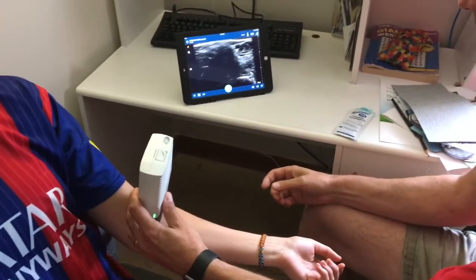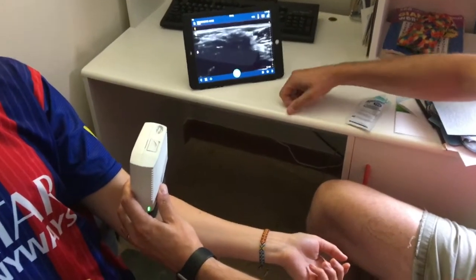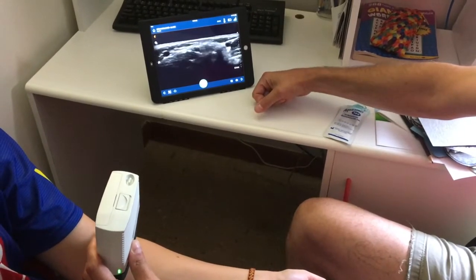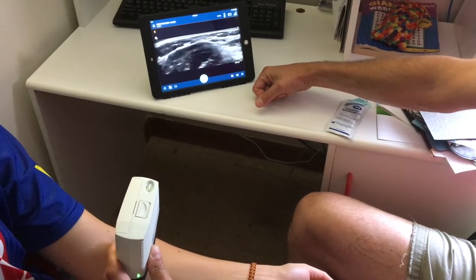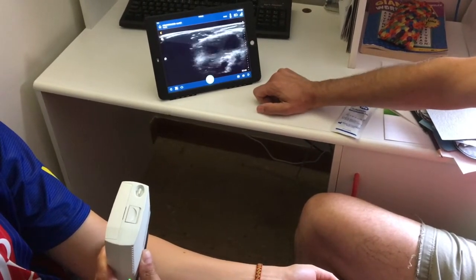We can swipe up for deeper and swipe down for a shallower look — this gives us 1.5 centimeters, which is pretty shallow. As we scan, there's really no lag time at all, and we have a pretty good picture.